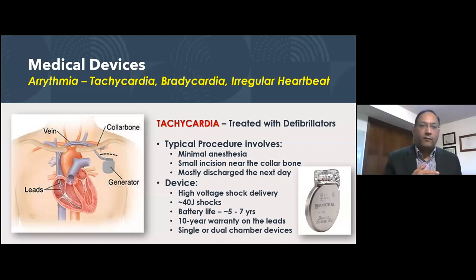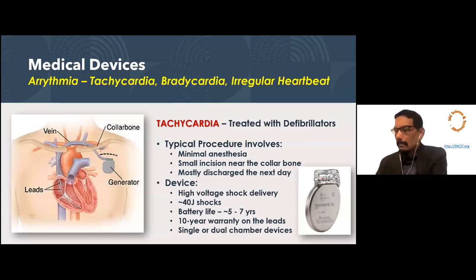And there's a lot of innovation that has gone into making sure that the data is not lost, because every single piece of information is very important. So there's a lot of redundancy in the communication as it goes back and forth. And the data you collect is from multiple different patients of different age groups and ethnic backgrounds, which can also help you say how to improve the next generation of devices, I presume, right?